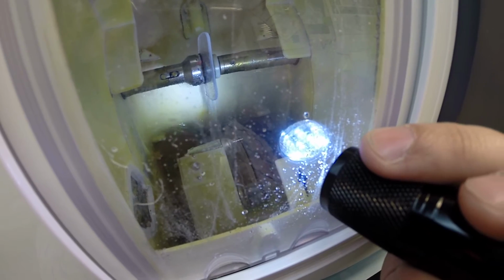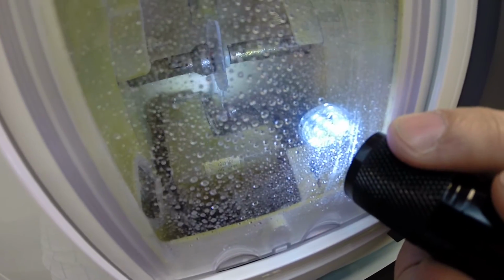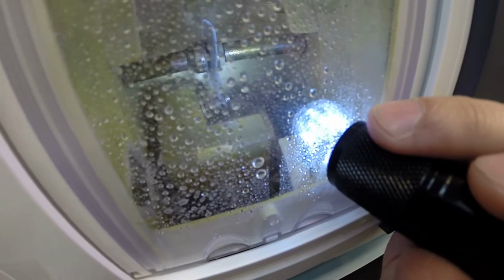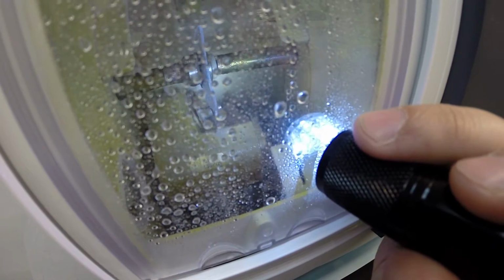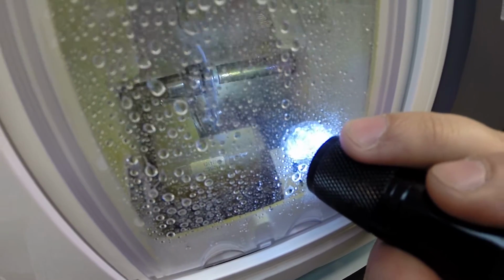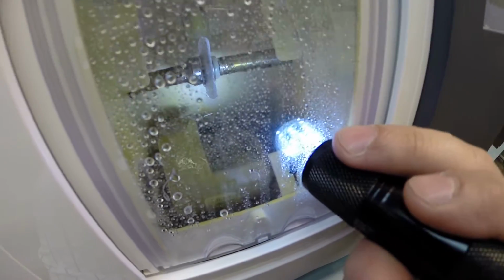The water has begun spraying onto the lens. It does that for the last 20 seconds of the cutting cycle. And again, onto the bevel wheel. Just to wash away any optical debris while it's cutting.